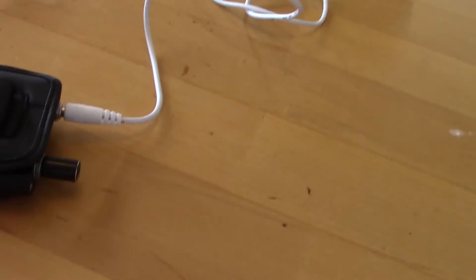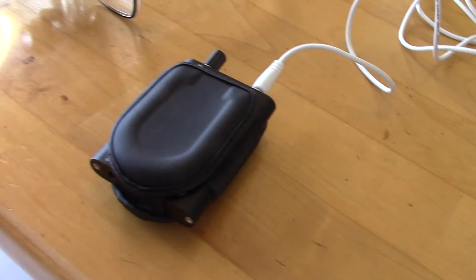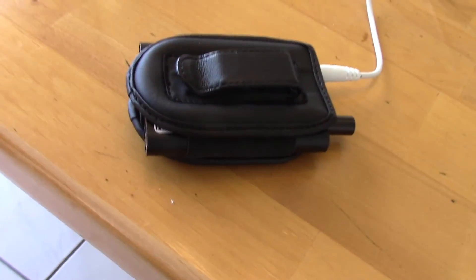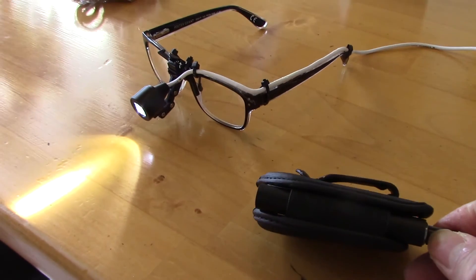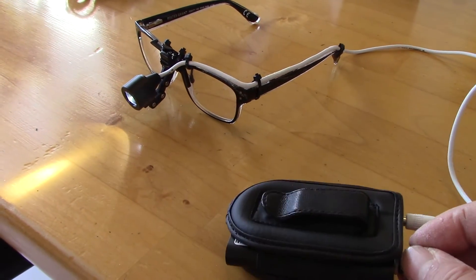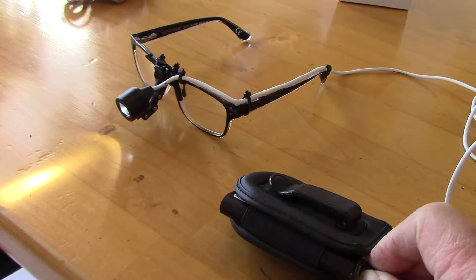Here's the battery. I put the battery in a universal flip phone case so you can wear it on your belt or on your operating apron. The light is variable — you can turn it off and on.